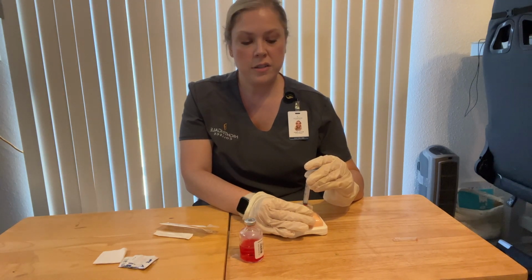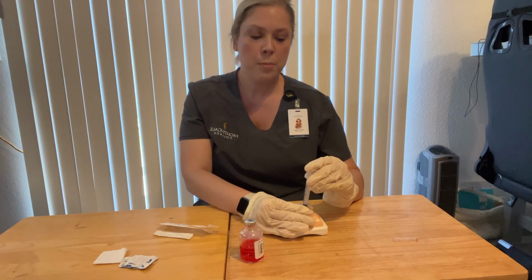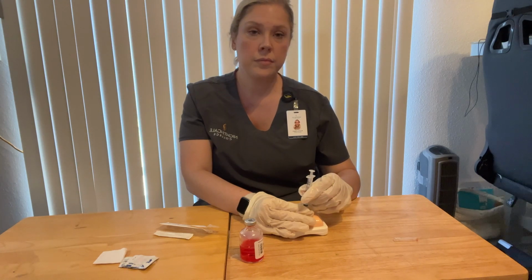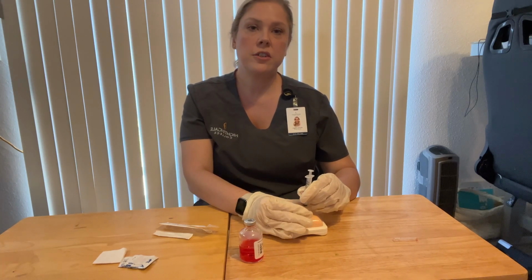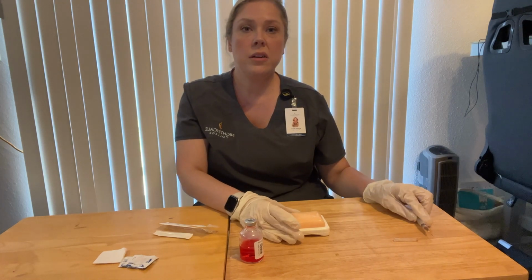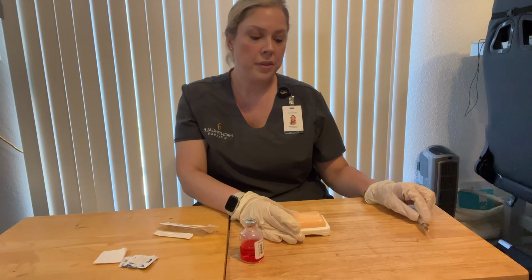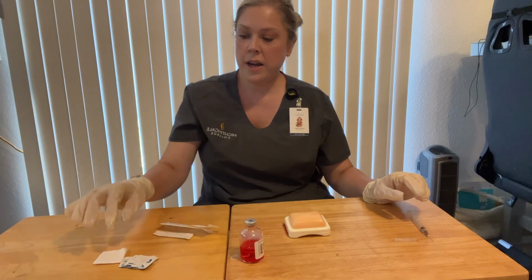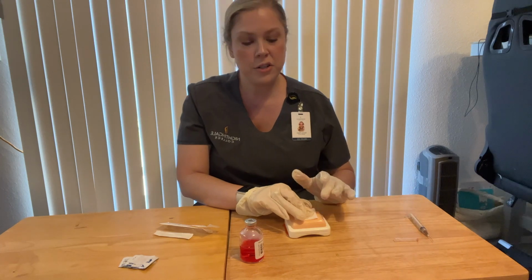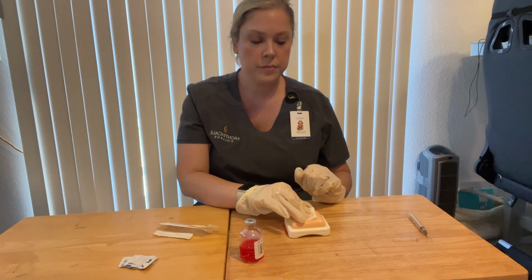Once all the medication is injected, we want to hold it in for about 10 seconds before we remove that needle. Okay, we'd want to release our traction, remove the needle, toss both the syringe and needle back into the sharps container. We do not want to recap that. We want to go ahead and grab a gauze pad and press it over the area with a little bit of pressure and make sure we do not massage that area.